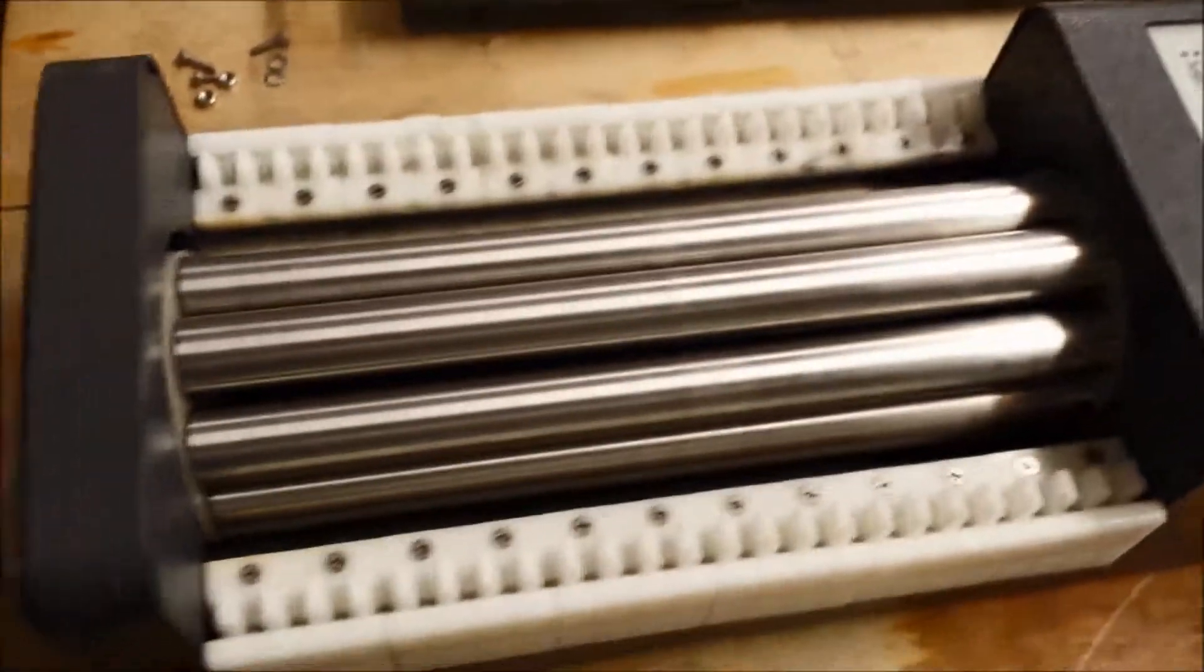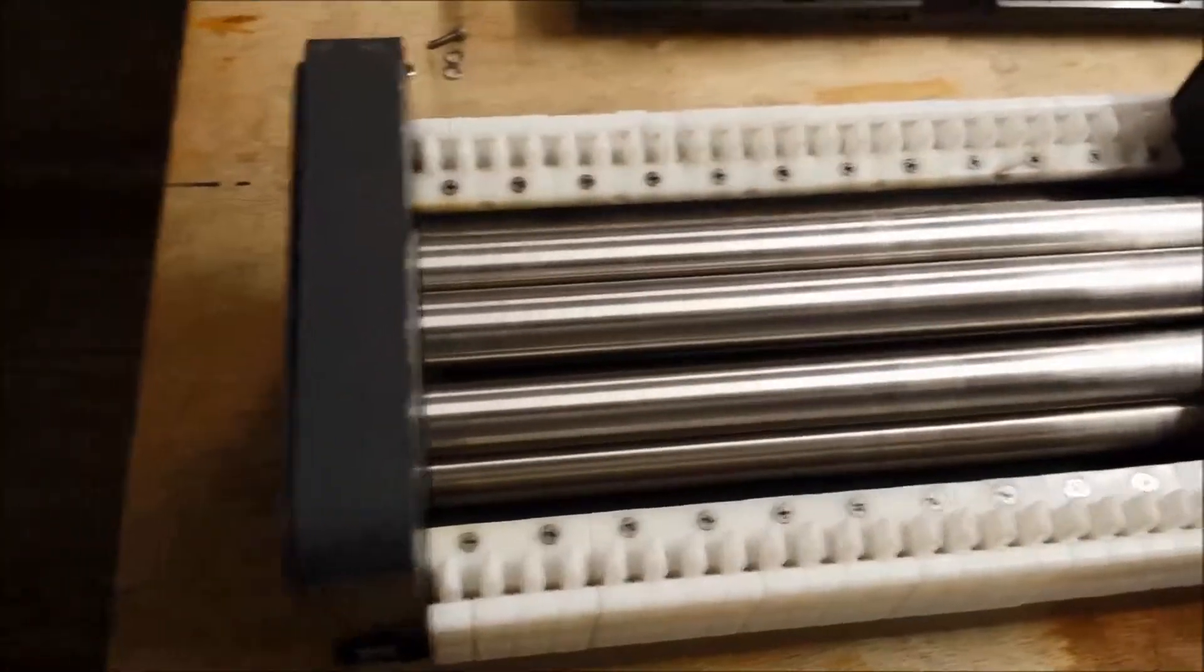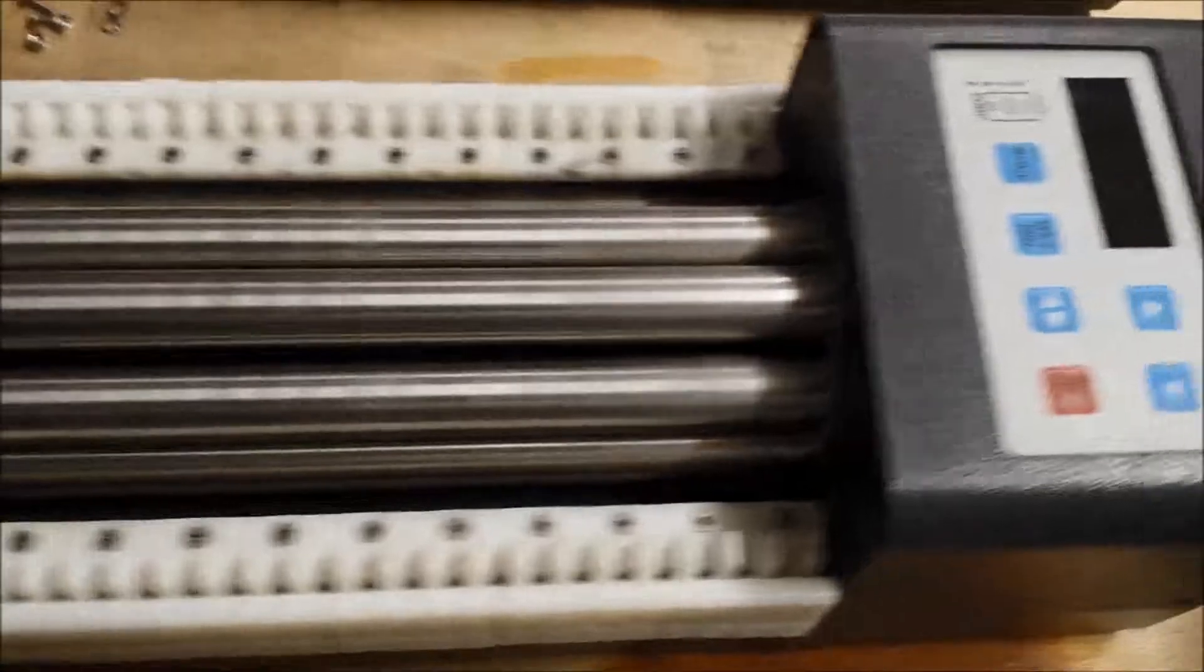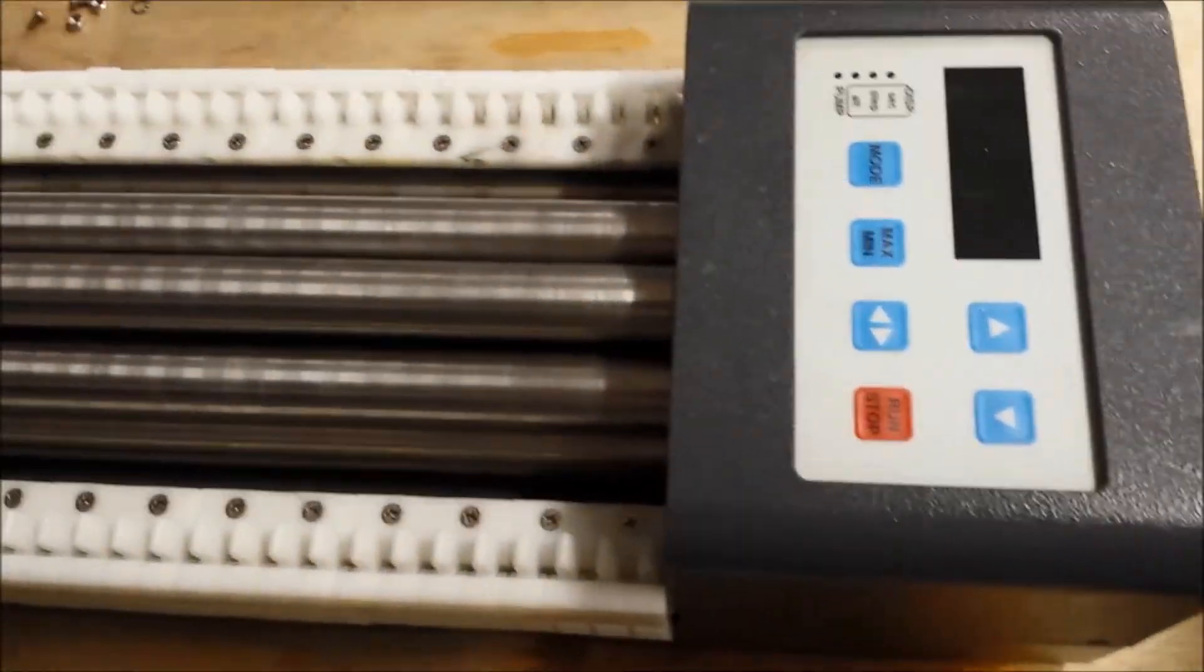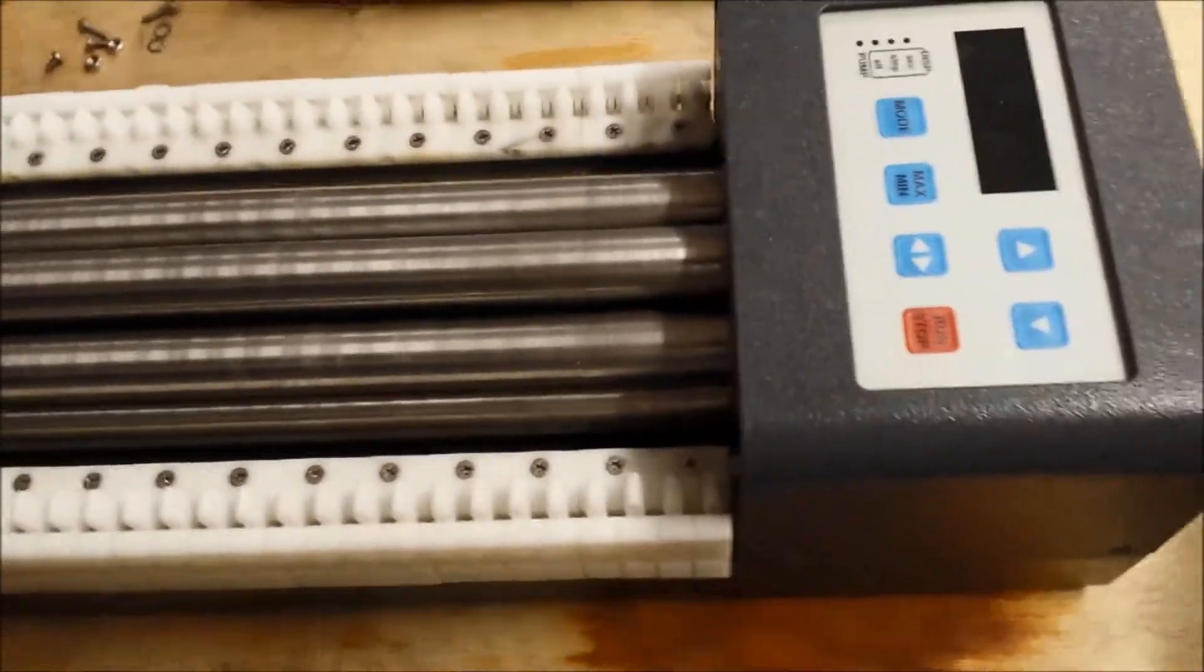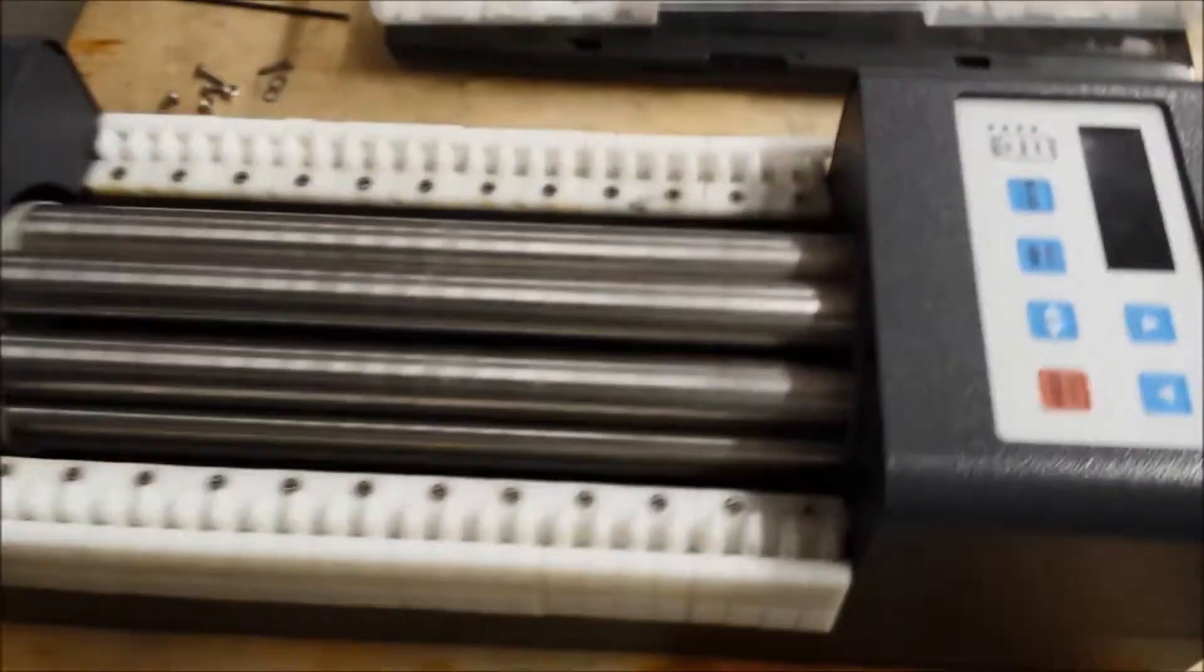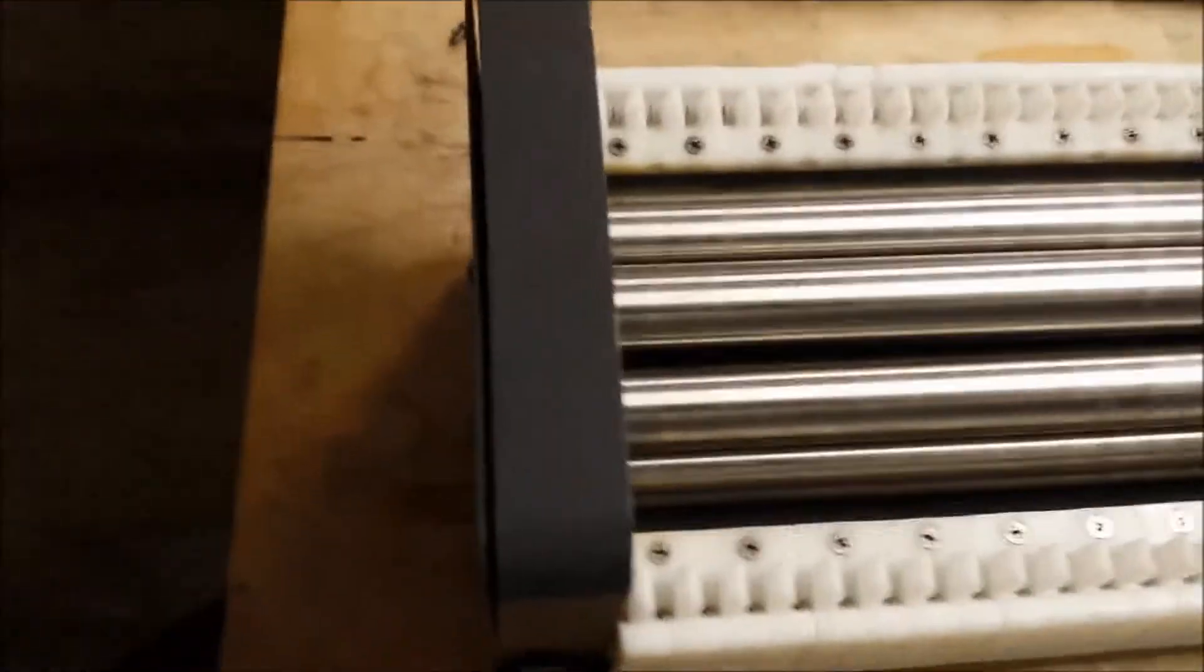Today we're starting a series on peristaltic pumps that are used with most of the flow systems. Some of the older systems have the pump in the actual module, but most have converted to using the peristaltic pump.